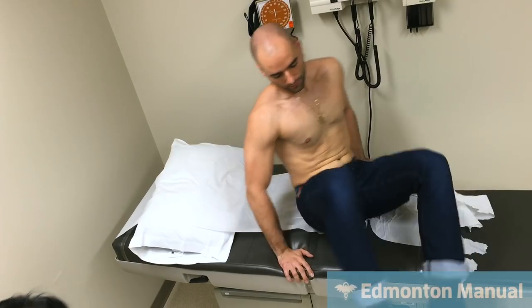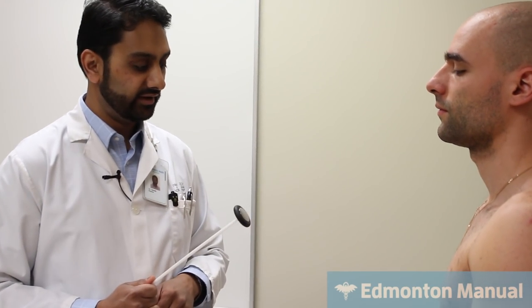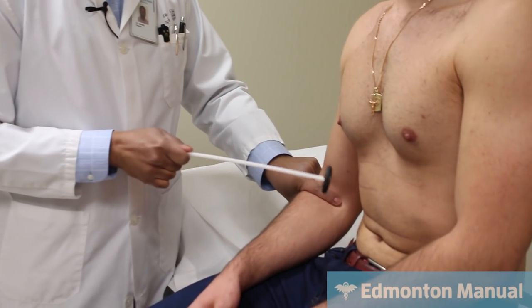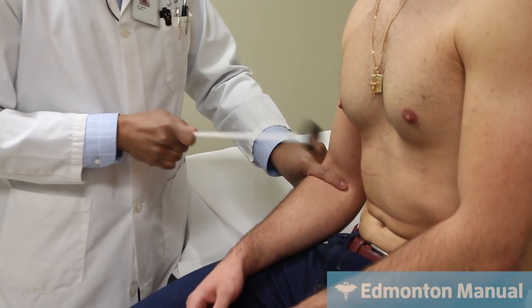So I'm going to ask my patient, if you don't mind sitting up, please. So we'll start with the Queen Square. And what's really nice about this is the long handle that kind of allows gravity to help you out a lot. So although you are still swinging it, the gravity will help bring the head down. So what we're going to be doing is just doing the biceps reflex to see the impact of it. I'm just letting it fall and hit the biceps. We can see the reflex very nicely.